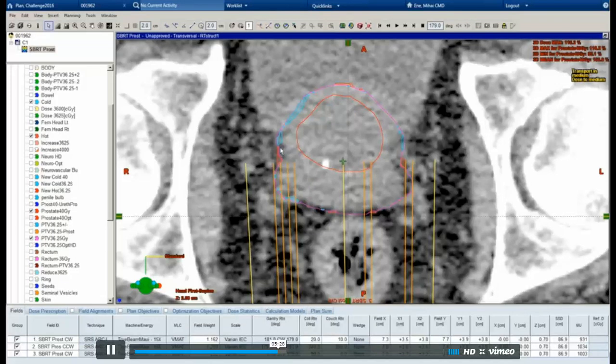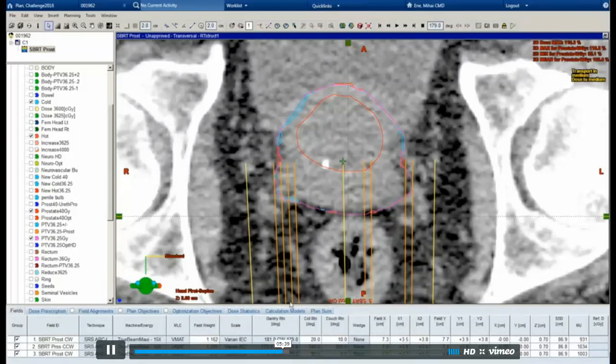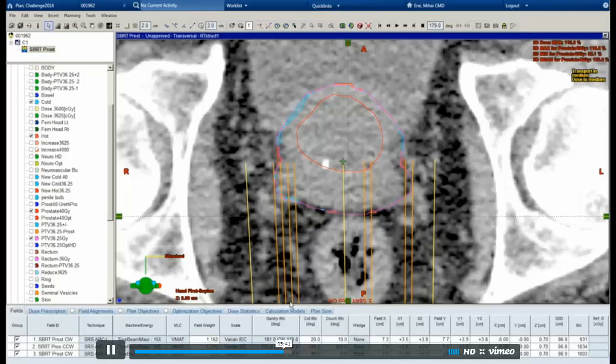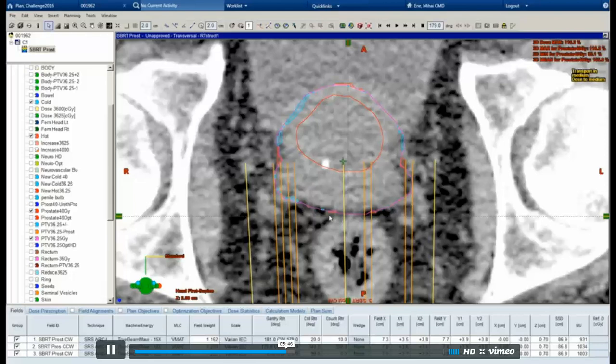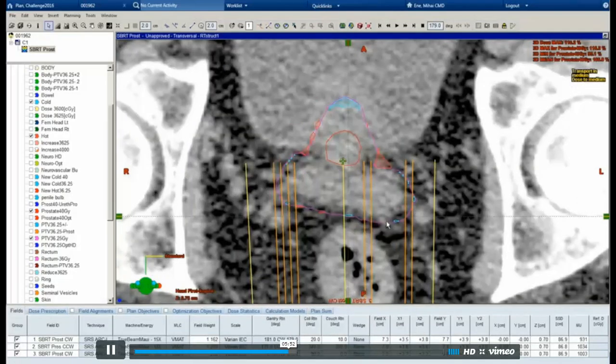What I did is I made these structures high def, and within the optimizer, I decreased their resolution. What that does is it lets the optimizer sample an increased amount of data points in this structure volume point cloud. So it seemed to really help. It helped with coverage, conformation, and such.